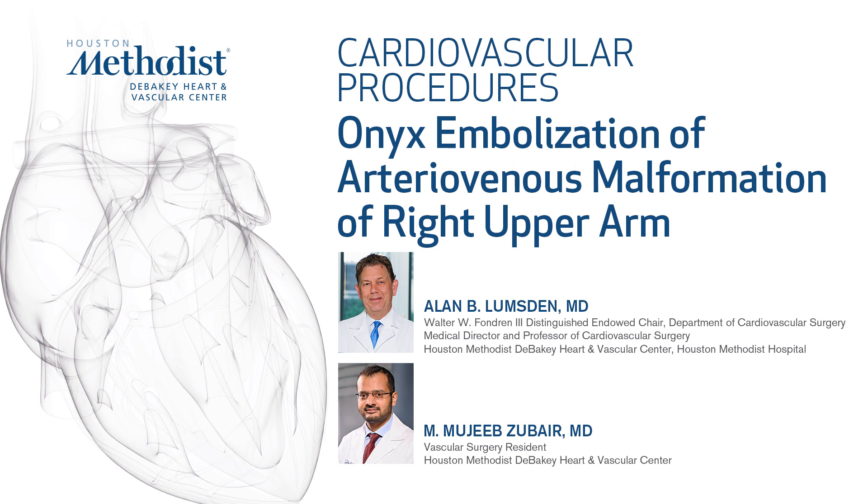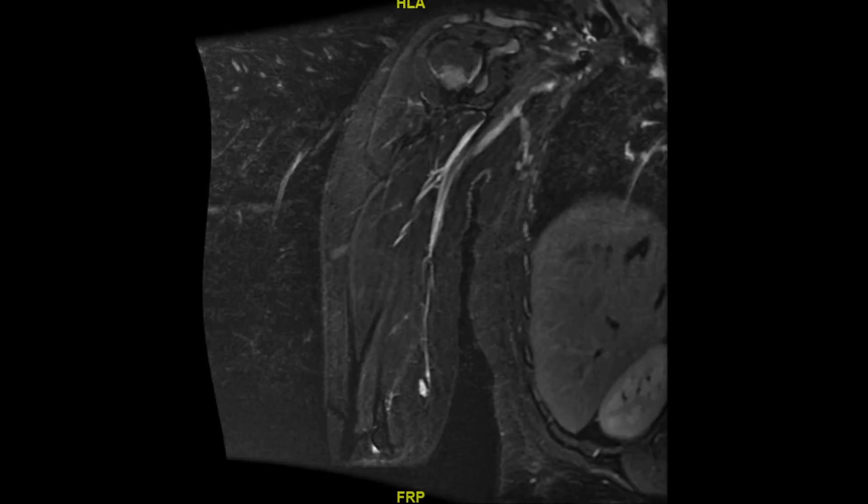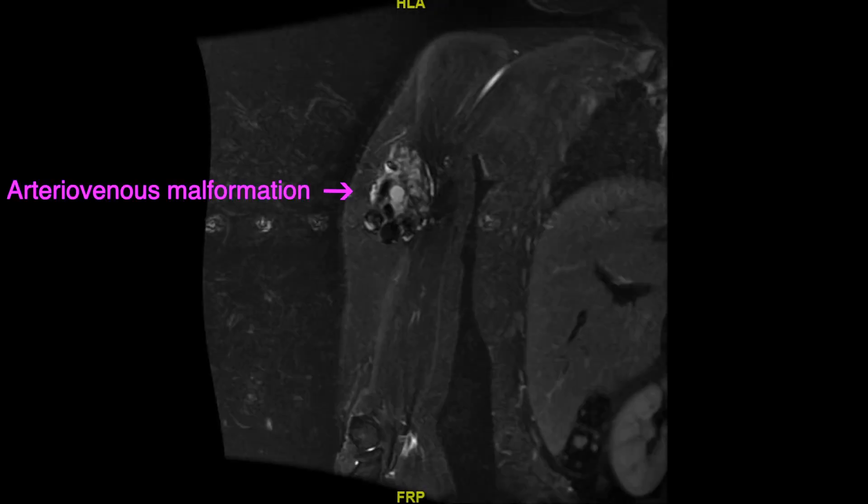This video demonstrates onyx embolization of an arteriovenous malformation in a 21-year-old female who presented with complaints of right upper arm swelling and pain.